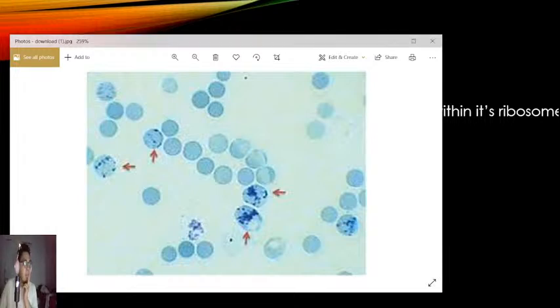Okay? So this one. Speaking of retics, magkaiba po ang reticulocyte sa nucleated RBC, ha? Yeah, actually yun. Ayan. Alright, so this is what a reticulocyte looks like. It looks like it's peppered with bluish spots.